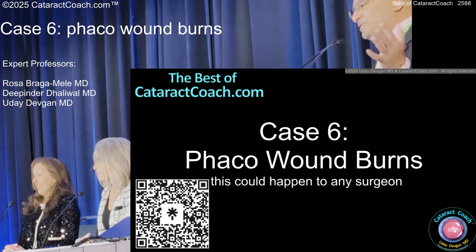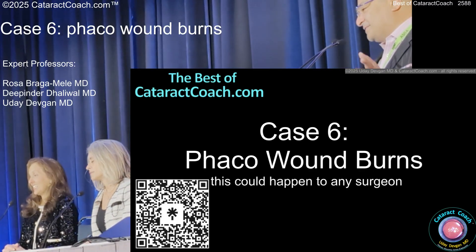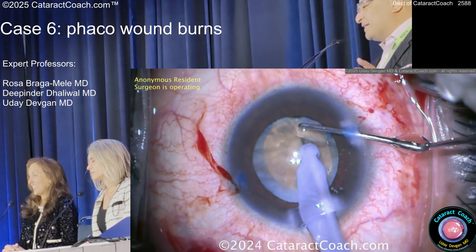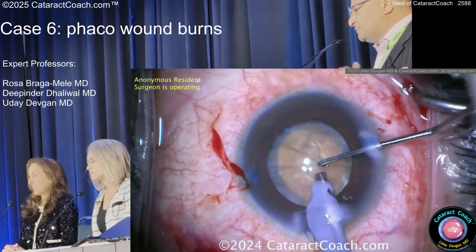This is a good one — you have to watch this. This is killer, this is amazing. I'll tell you the answer to the FACO wound burn right now. Starting off, rather than operating, where is the needle in the FACO sleeve?